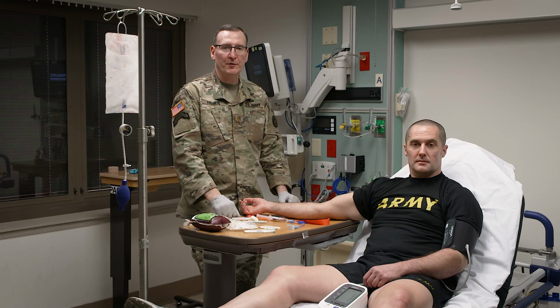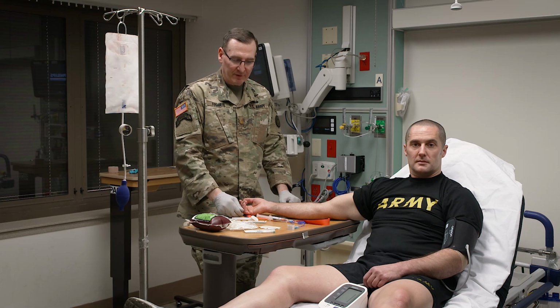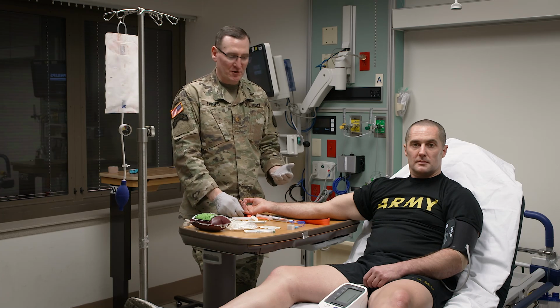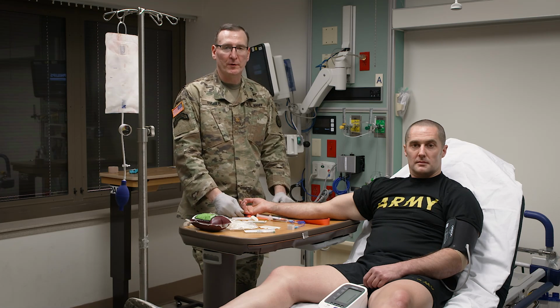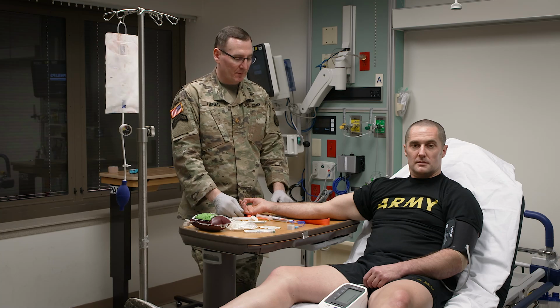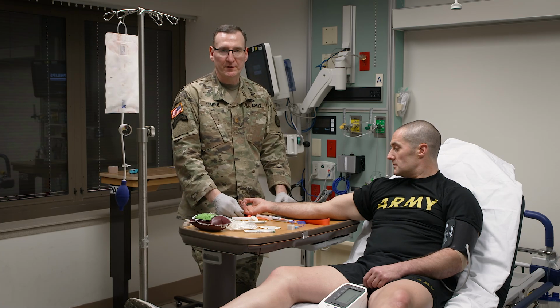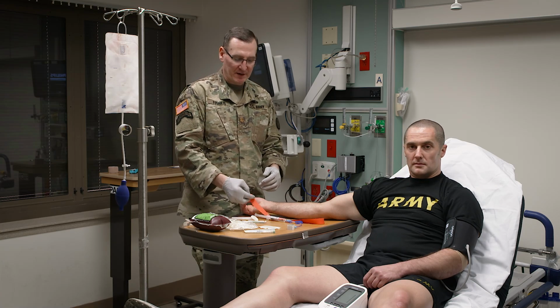All right, we're going to begin our transfusion process at this point. What you'll need is a simple IV starter kit. During any sort of intervention that you may do on a patient or casualty, you may ask someone to collect the fresh whole blood for you. During that time is when you will go ahead and start the IV. If you have to collect the fresh whole blood yourself, you may have to come back and start the IV on your patient.